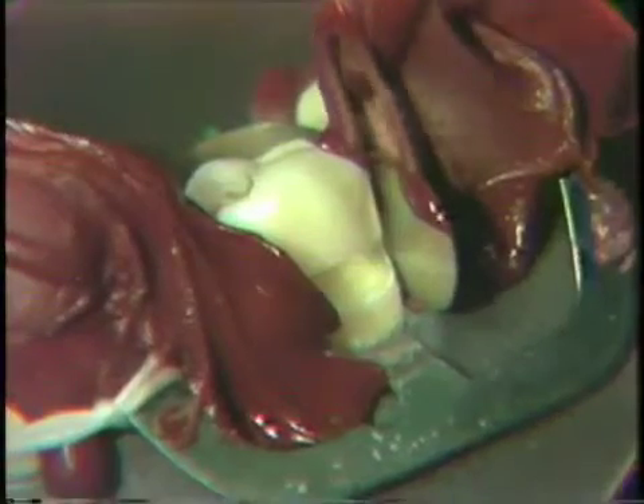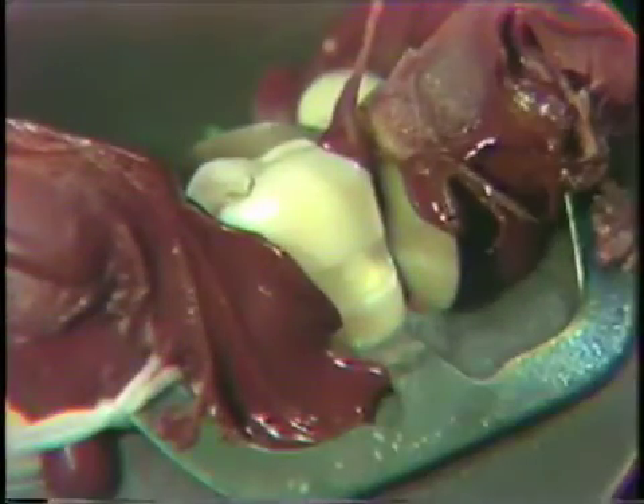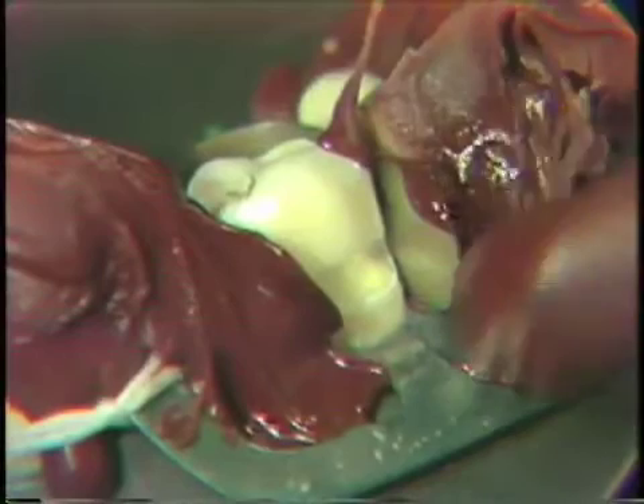Gently remove our instrument. It may be necessary to add a bit more compound to make sure that we have backed up the matrix. What we're trying to do is to form a fourth wall extending out buccally so that we can condense against this.